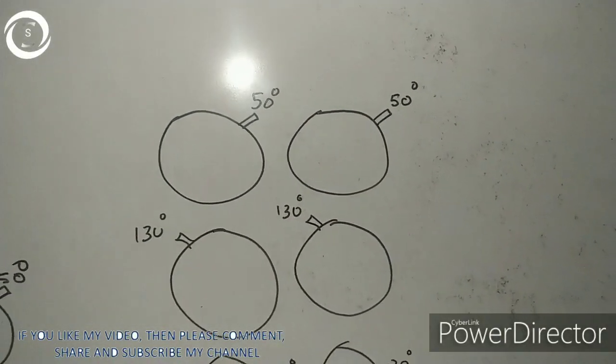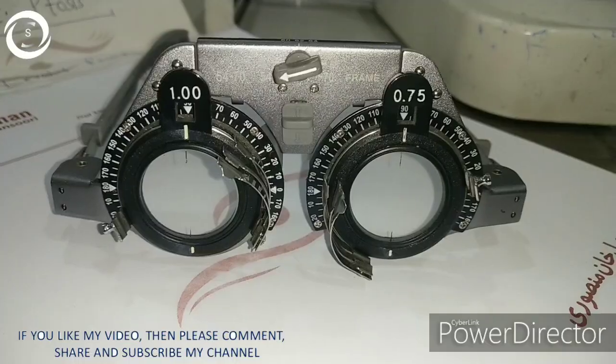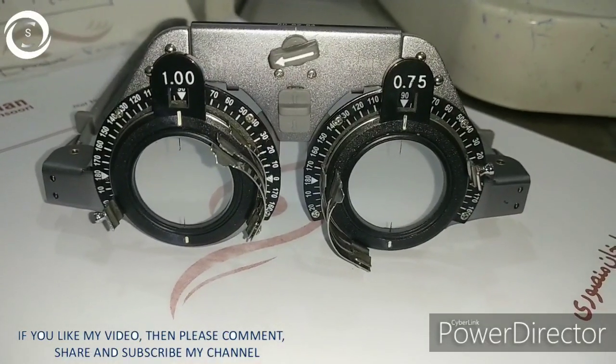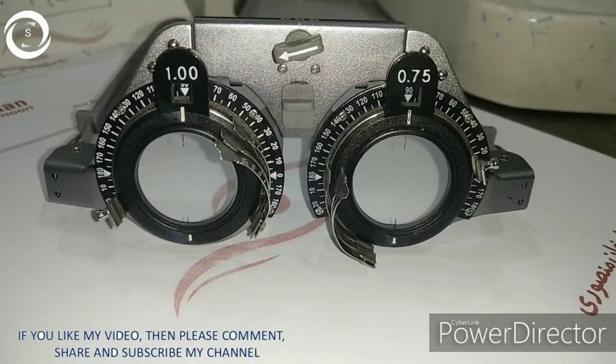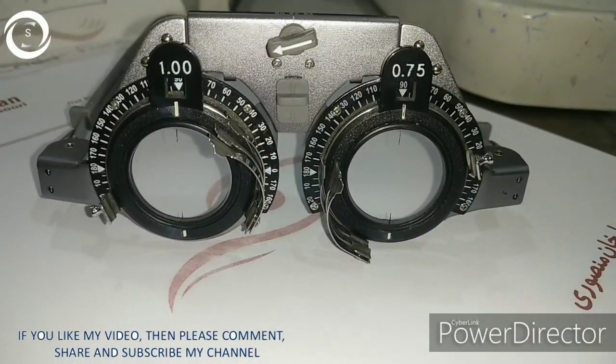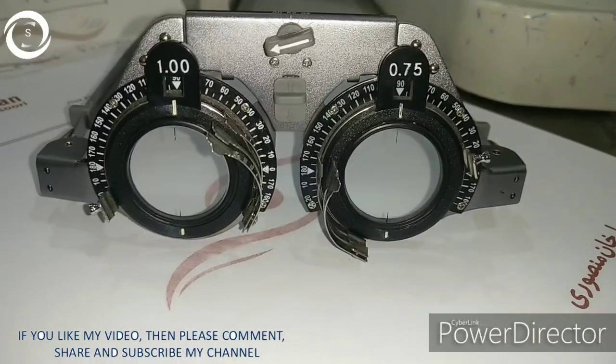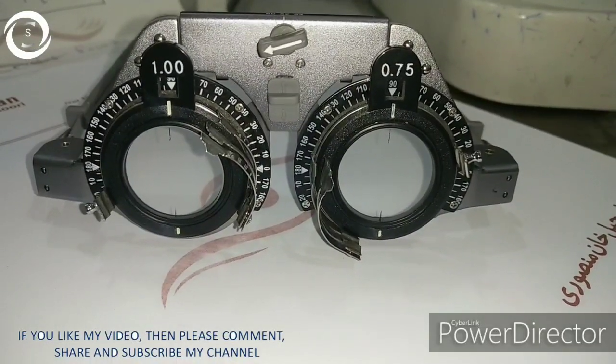And now I will show you eight practical examples. Now this first patient has hyperopic astigmatism. Both eyes at 90 degree. If it's not exactly 90 degree, it should be within 10 degrees to each other.